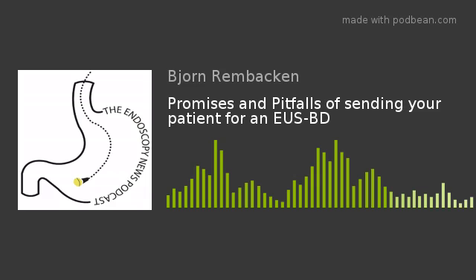Will protracting this procedure and avoiding successful biliary drainage from occurring on the day cause them detriment? That's what you've got to ask yourself. And if the answer is yes, then reasonably quick decisions have to be made to progress from standard cannulation, ancillary techniques such as fistulotomy, and if that fails, then consider EUS-BD.